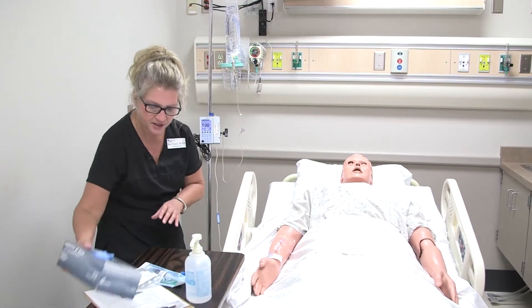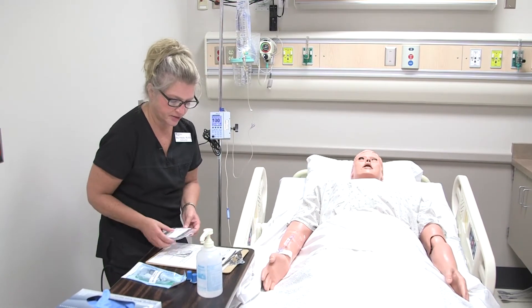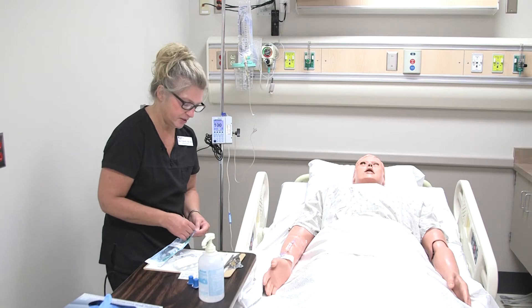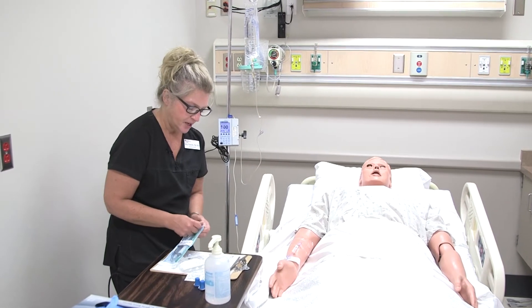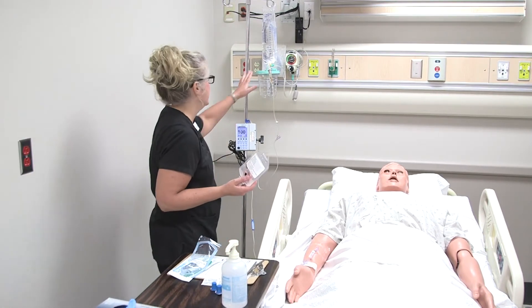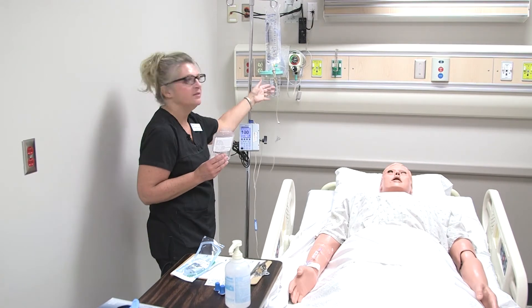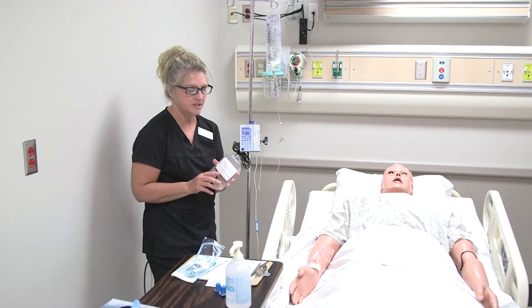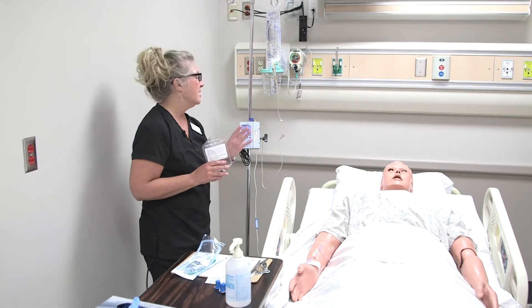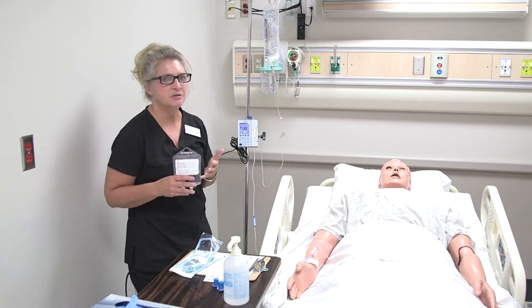All right, so we're going to go ahead and get that started. I already did my first two checks on my medication at the Pyxis, and now I'm going to do my third check here in the room with my computer and my scanner. Now that I've completed that third check, I'm going to get my equipment and medication ready. Prior to giving any medication through an IV that's already running, since this is your primary IV with normal saline, you want to make sure that whatever you're going to add is compatible with that solution.